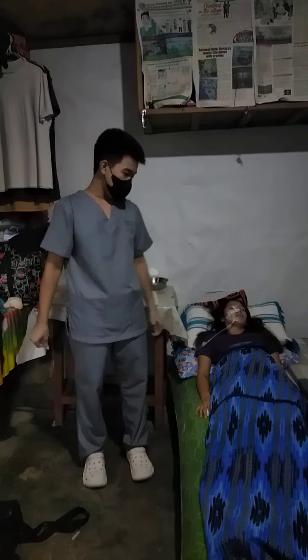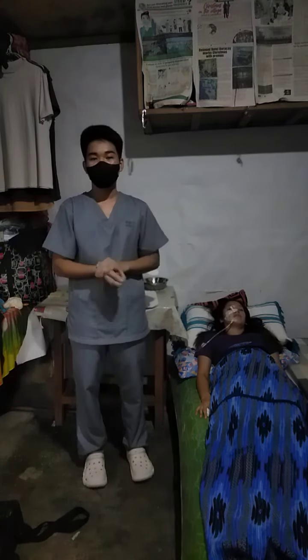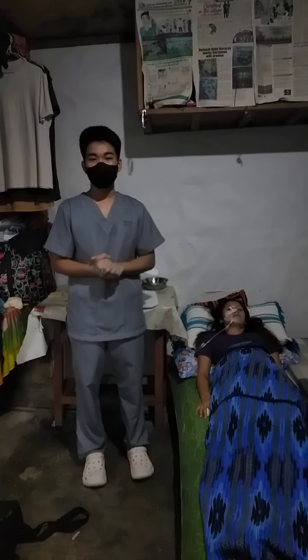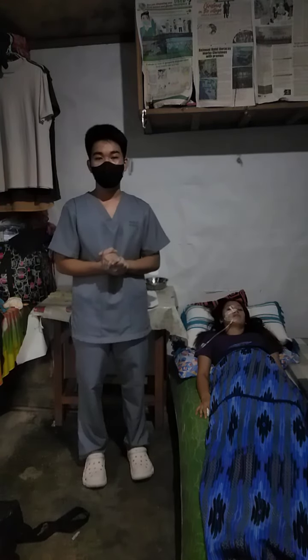And now, I'll be performing the removal of the nasogastric tube. So first is to verify the order of the doctor to discontinue the nasogastric tube. Then explain the procedure to the client.